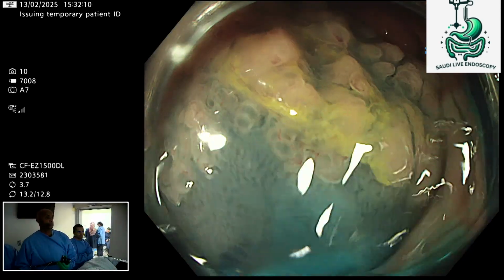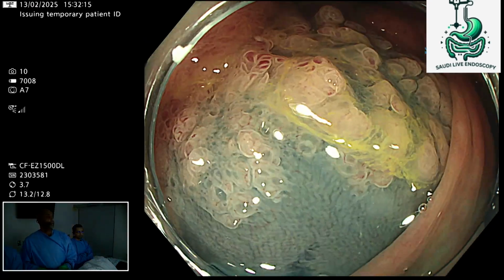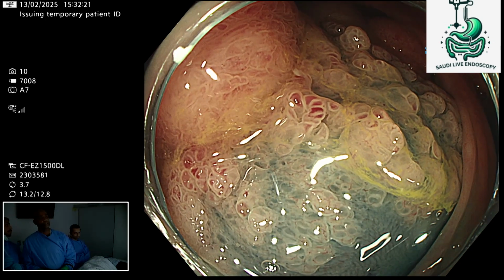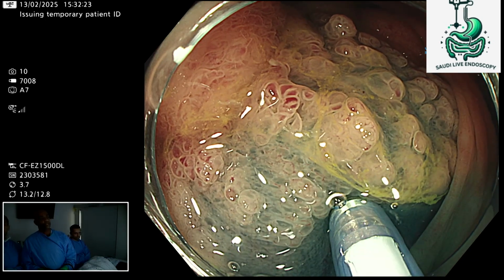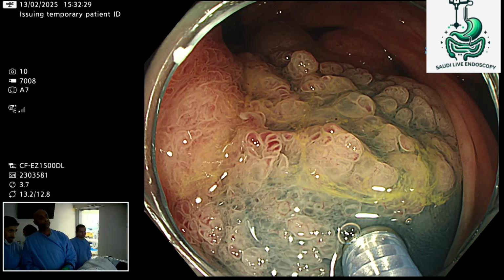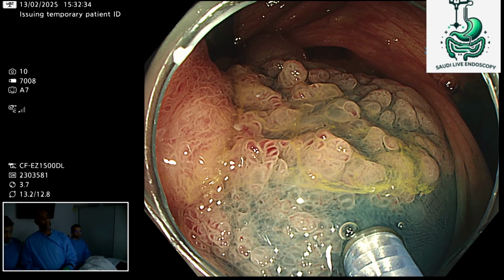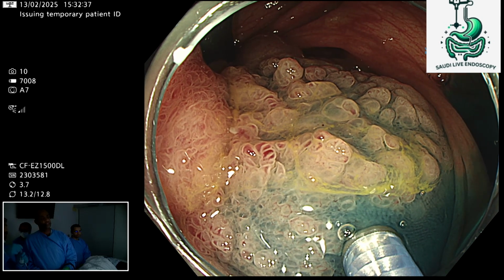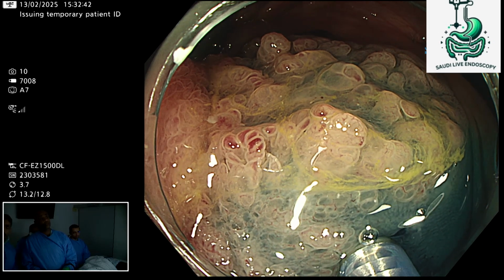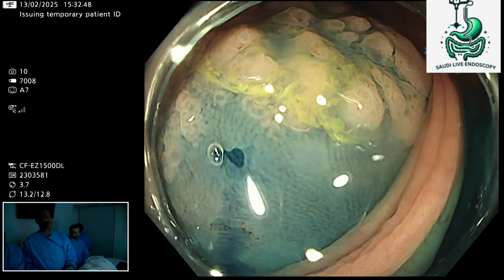When you inject, is it better to inject from the proximal or distal side, or it doesn't make a difference? It doesn't make a difference. I think it's up to you, but in this situation here, the rationale, needle out. Inject now. The scope is much more stable on retroflexion, and I want to start on the retroflexion side just to clear the edges, and then we'll probably work our way, me and Majid exchange, keep injecting. We will then work our way from the forward view and try and join them together, but there's no rule for it. But I feel that this part is the most difficult part.